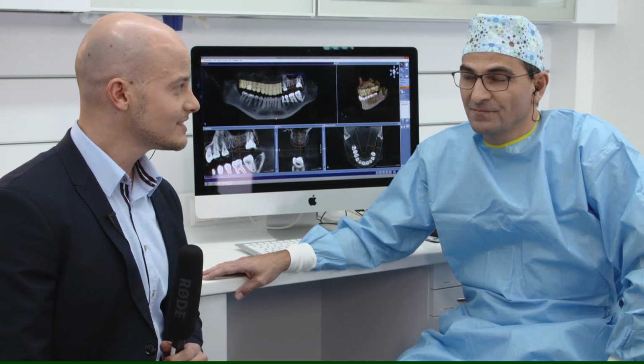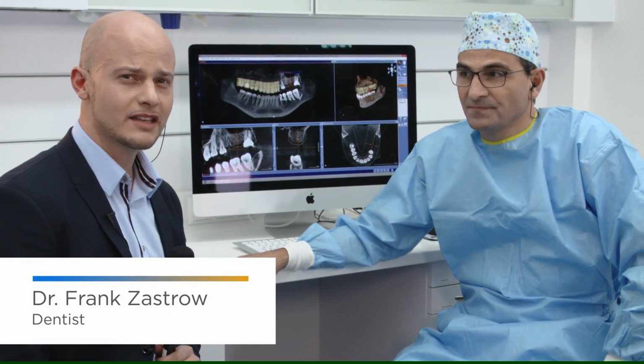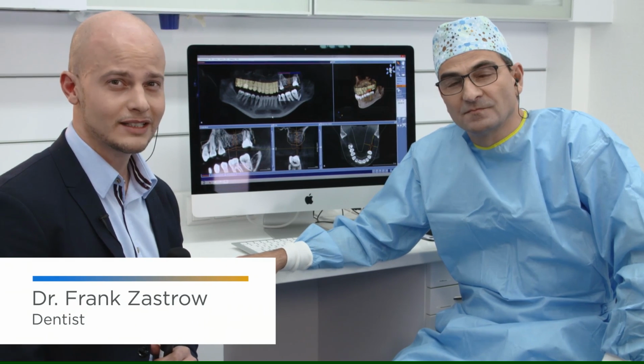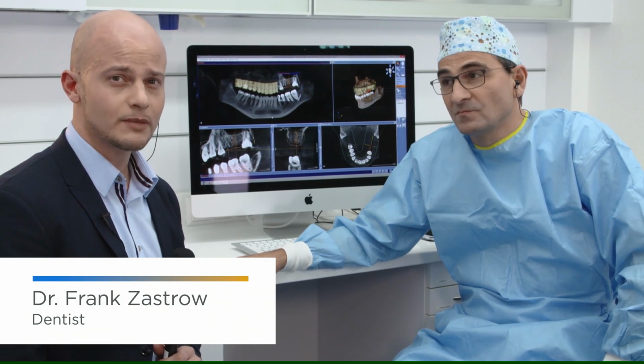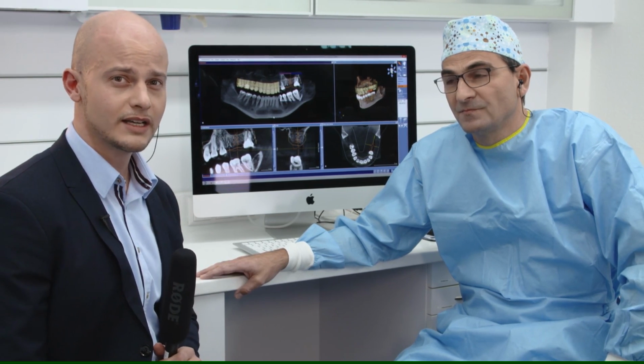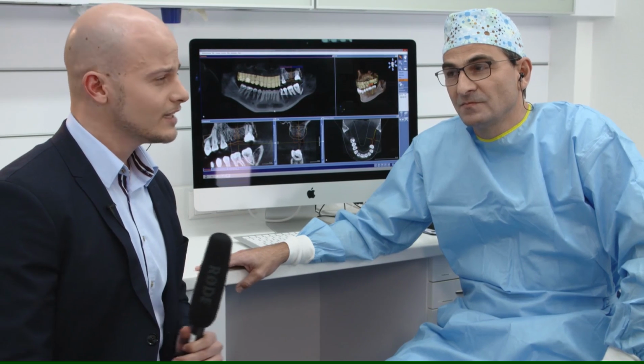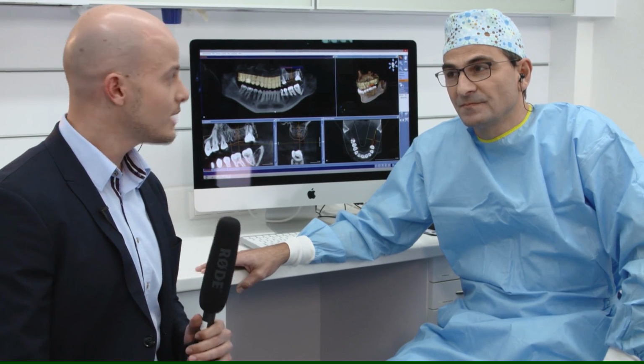On my side is my colleague, Dr. Gerhard Werling. We are here in the southern part of Germany, and he is an experienced implantologist. He has placed thousands of implants in the last 25 years. Gerhard, it's nice to be here. Can you tell us something about the case and the patient?